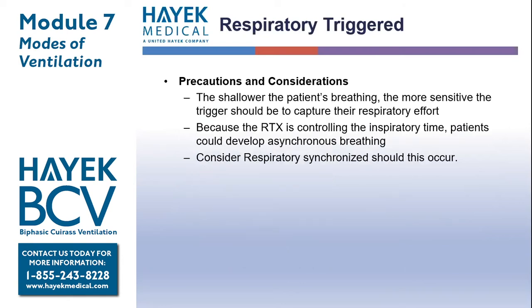The shallower the patient's breathing, the more sensitive the trigger sensing should be to capture their respiratory effort. Because the RTX is controlling the inspiratory time, patients may develop asynchronous breathing. Should this occur, consider respiratory synchronized.